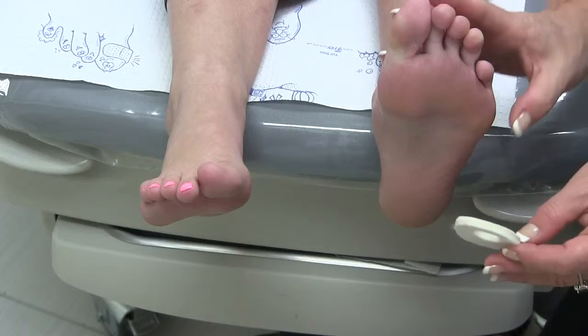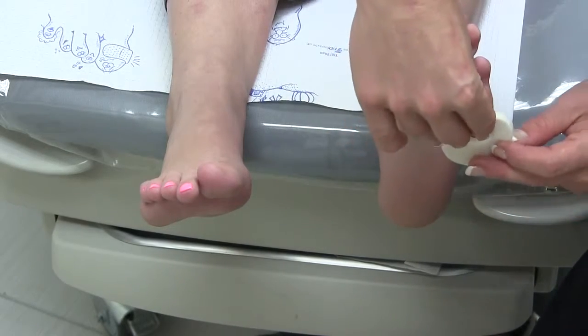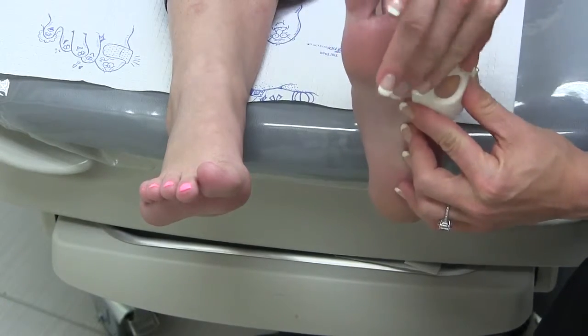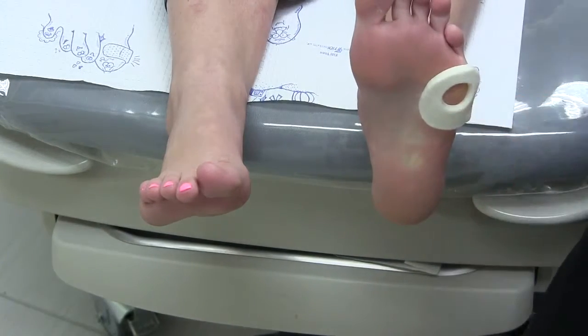Let's pretend that Ashley has a sore spot here, and we're going to place the pad on it. It's going to stick on it and stick in place, and she's going to wear it until it starts to loosen and come off.